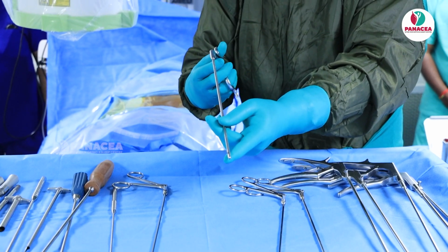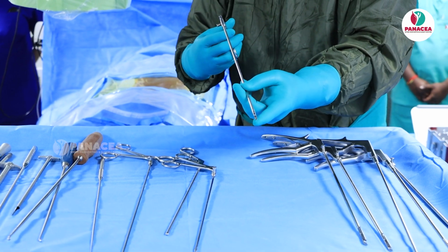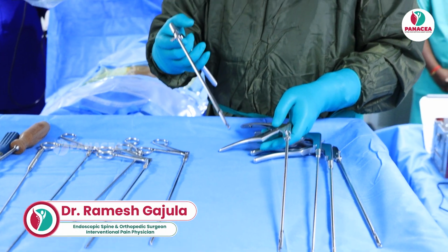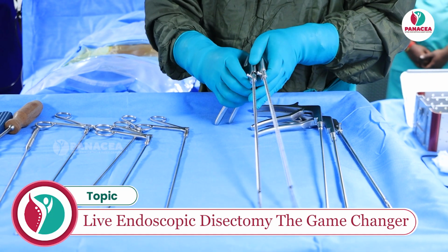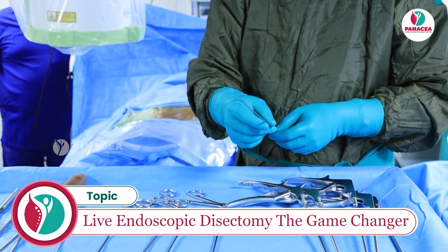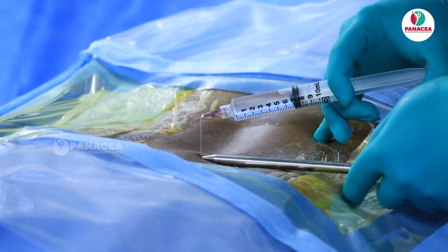These are pituitary rongeurs. You can see the graspers, a serrated plain grasper. This is a disc forceps. It is curved, and these are nothing but the Kerrison punches. They are almost similar to the conventional open spine, but the only thing is the working length is more. We have in our ornamentarium 2 mm, 3 mm, 4 mm, and finally, this is the annulotome knife. So these are the instruments which we are going to use for this case today.